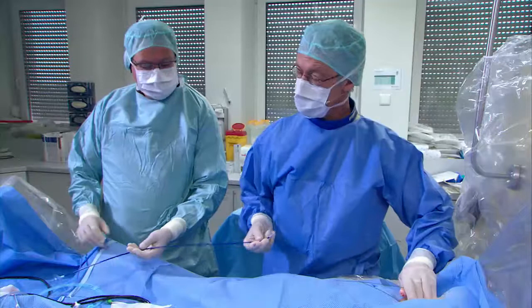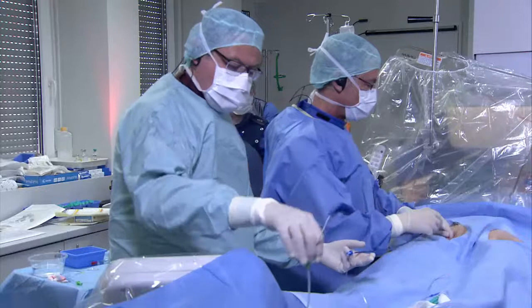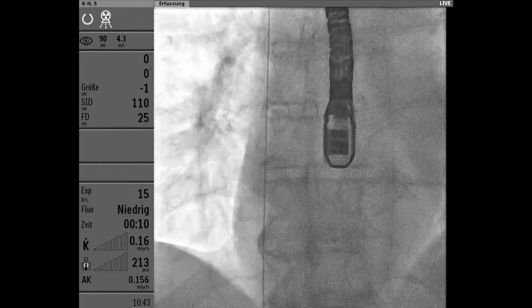We will do the transeptal puncture using radiofrequency technique, which has been around for a couple of years. We rarely use it for specific reasons, but Martin uses this all the time. Martin, why are you using radiofrequency technique for transeptal puncture?